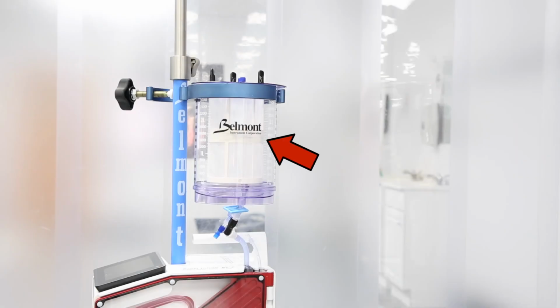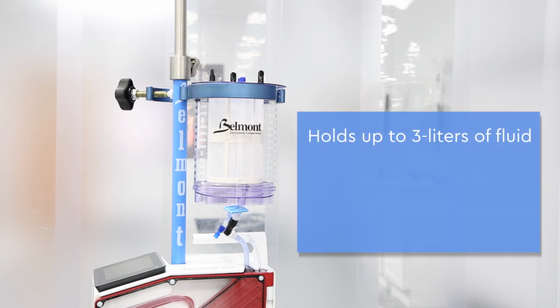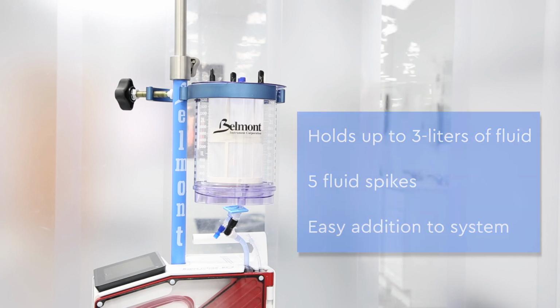The optional large volume reservoir can be added at the beginning or any time during the procedure. The LVR will hold up to 3 liters of fluid, has 5 fluid spikes, and can be added to the system in less than 1 minute.